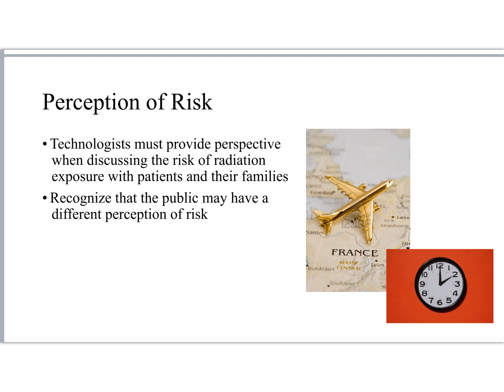So that has to do with our perceptions of risk. And perception of risk is a significant thing. For example, some patients might be more concerned with the claustrophobia than other things. People become familiar with things, or there's a lack of understanding. Sometimes scientific uncertainty makes people say, oh well, it must not be a big deal. They're not sure what's going on, so not a big deal, right? Whether or not it's within our control is another way to think about risk. And then the impact on children.